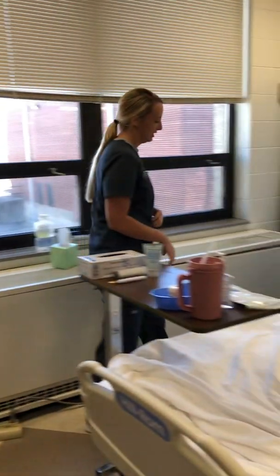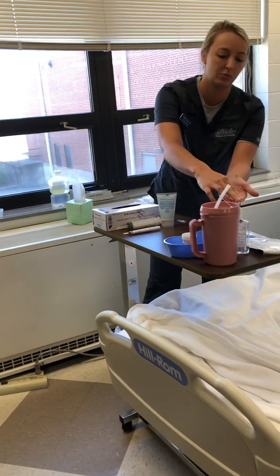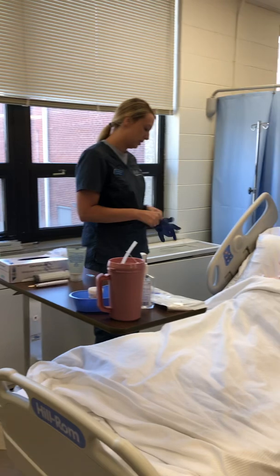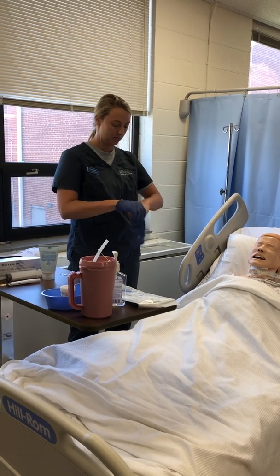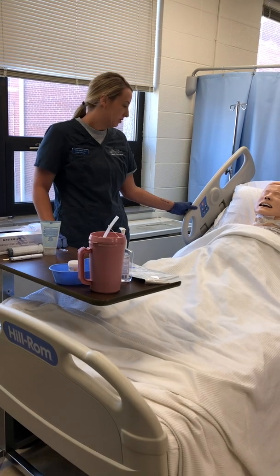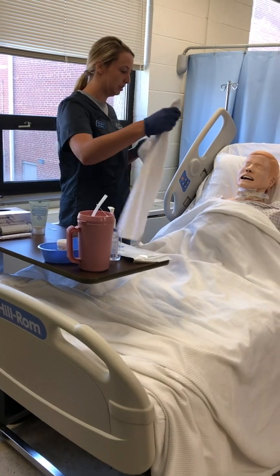Hi, Mr. Jones. My name is Cassie. I want to be your student nurse today. Can you tell me your name and date of birth? Awesome. We're going to be putting an NG tube in today, and then I would explain the procedure to my patient and provide privacy. I would raise the bed and then put them in high Fowler's position. Put a towel over them in case there was any mess.